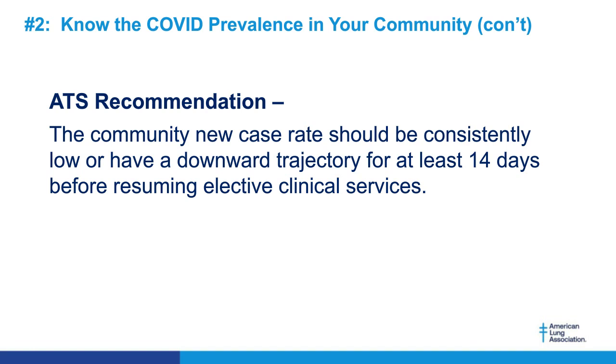They also make a statement on that same statement. These statements are included in the links below that Jill told you about, so you can bring these into your own lab and read them. The ATS also made the statement that transmission of the SARS-CoV-2 is a dynamic process, and therefore it is likely that the prevalence of COVID-19 in the community will wax and wane. The impact on the institutions needs to mitigate this. Operating procedures should be frequently assessed and modified as necessary.